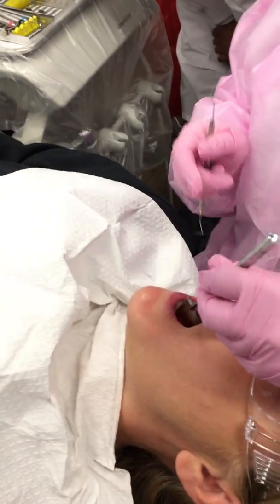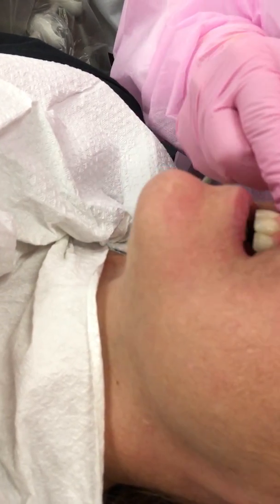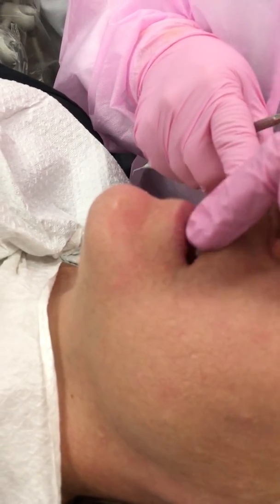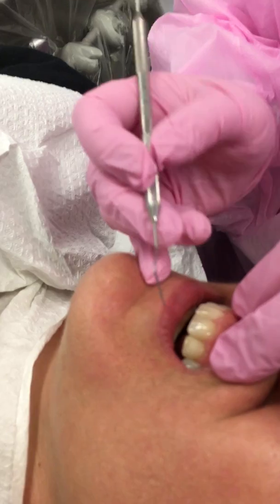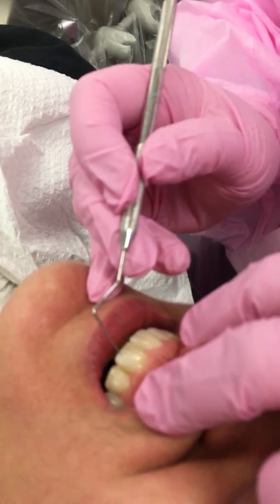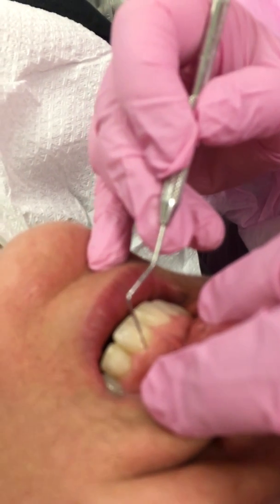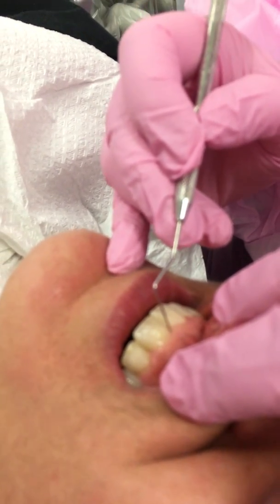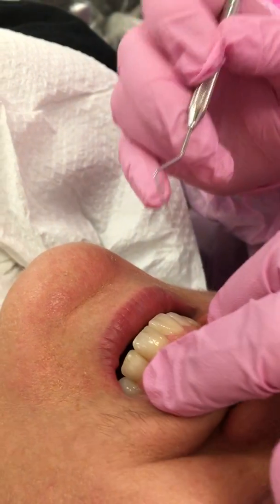Okay, so we would have looked in and looked around, okay? So remember yesterday we talked about some anatomical features of the gingiva, right? Okay, so this line right there was the free gingival margin, correct?